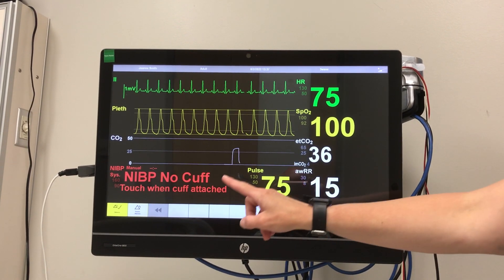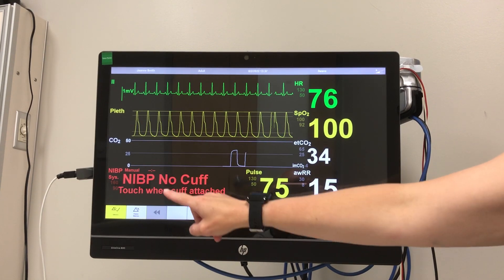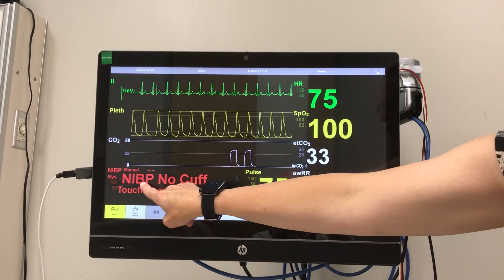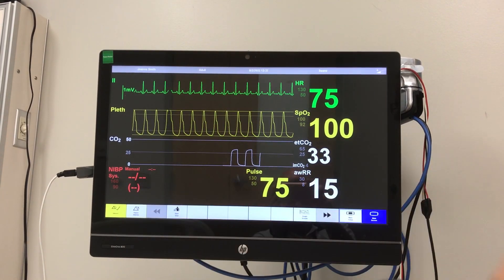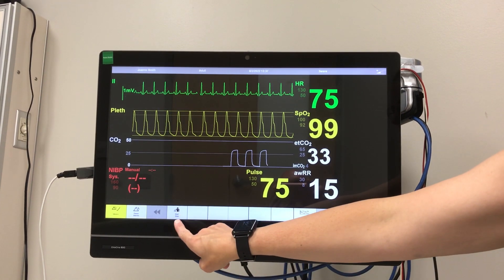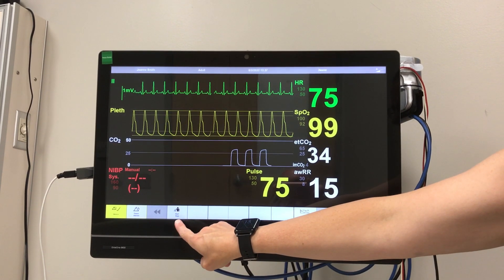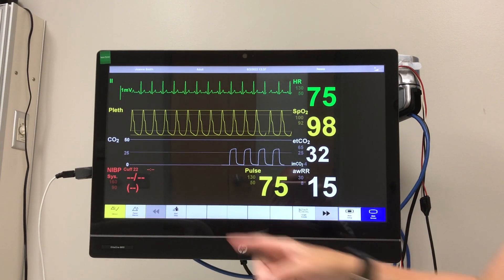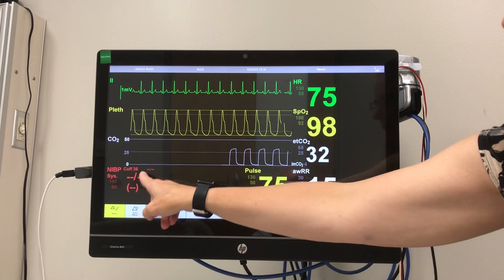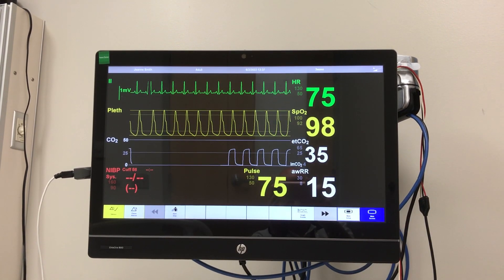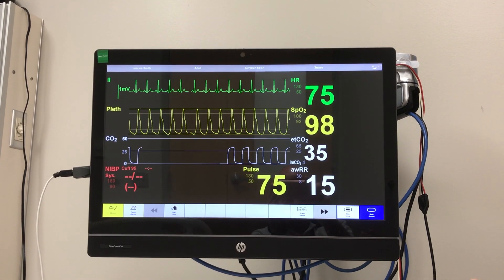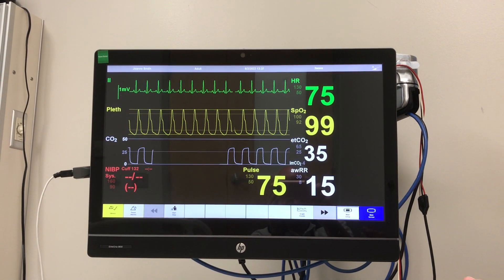The last thing on this screen is the blood pressure cuff. Once the blood pressure cuff is attached, you can touch the red area there. There's a button down here that says start/stop. Once you press it, you'll hear it beep and you'll see that the cuff is inflating. It takes a little while — it's not instantaneous. Just give it a little while to pump up and then deflate and it will give you a reading.